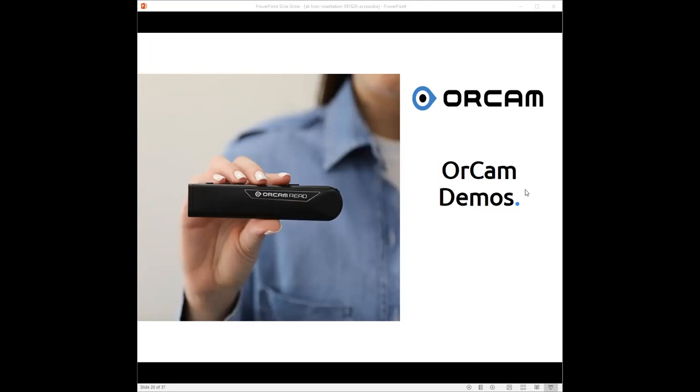I think I wiggled it a little bit. One of the things that's important to do is to hold it straight and steady until you hear the shutter sound and then you'll have a clearer read. One of the wonderful things about OrCam devices is that there's no storage maximum. When I take a picture, I listen, but then that content is not stored in the device. So it's unlimited in terms of how many pictures I can take. We don't have to be worried that we're going to use up a limited amount of space like a computer.